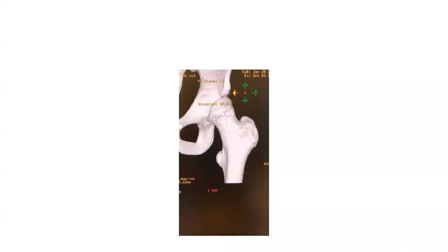Why? Because the knee could be dislocated, there could be a distal fracture, the hip could be subluxed, but more importantly, there might be a femoral neck fracture. 5% of the time there is. And if you miss it and you fix the femur fracture and you notice the femoral neck fracture later, guess what? You're going back to the OR to fix it. So when someone comes in for a high energy trauma in a motor vehicle accident, they have a femur fracture, we will often get an X-ray with the hip internally rotated because it makes the femoral neck longer.